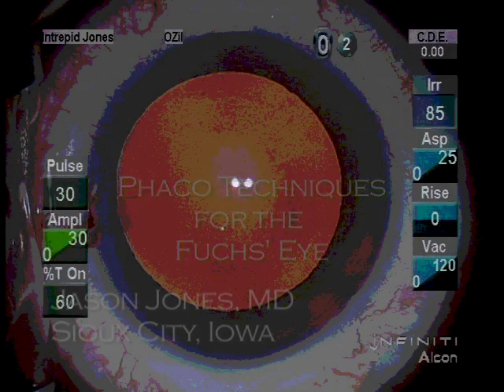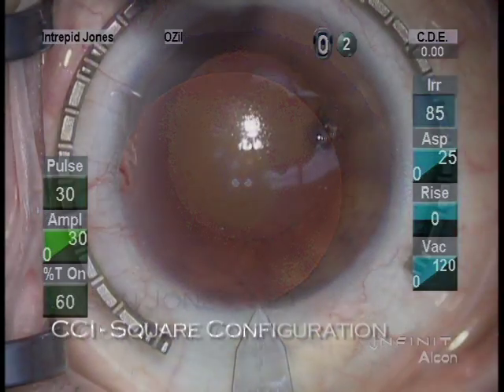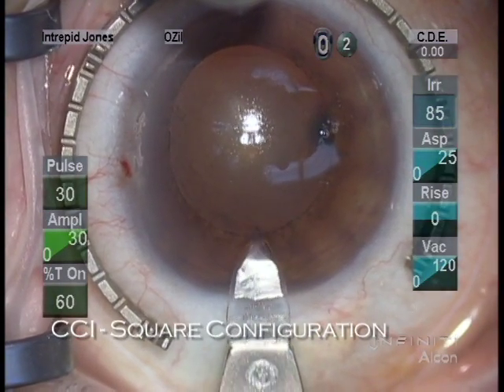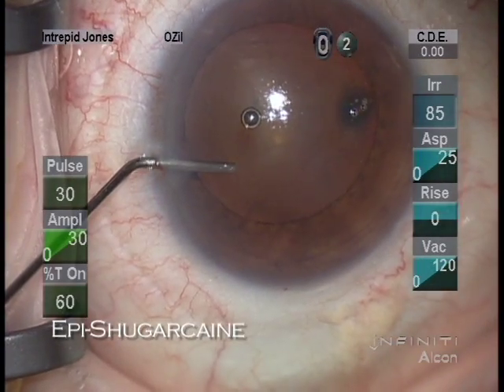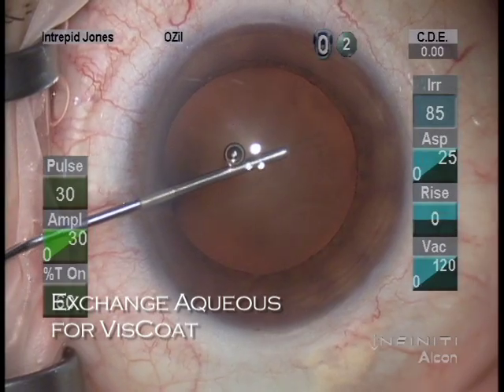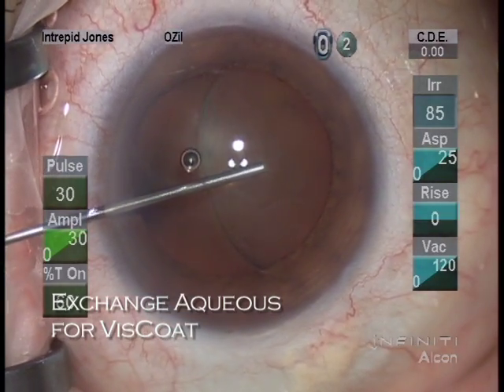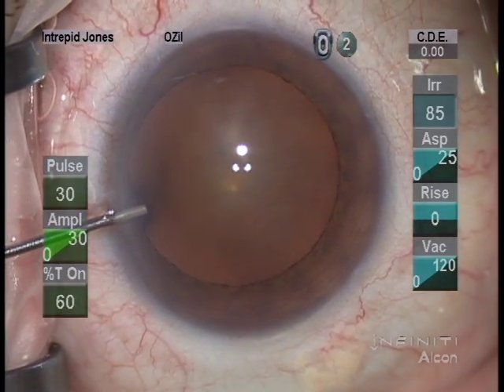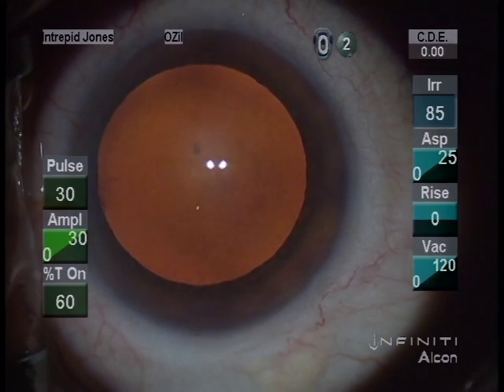When I consider cataract surgery in the presence of Fuchs corneal endothelial dystrophy, there are certain elements that can be emphasized in order to maximize the safe outcome from the procedure. A clear corneal temporal wound is utilized that is square or over square to ensure an adequate tunnel length and good closure.